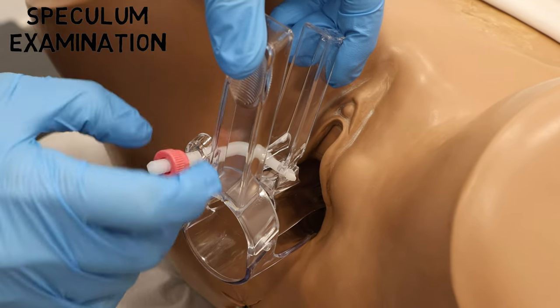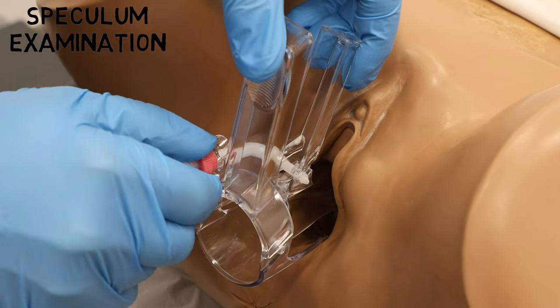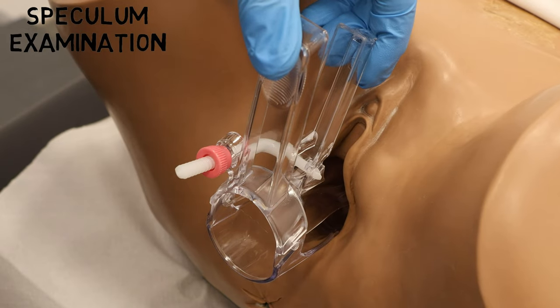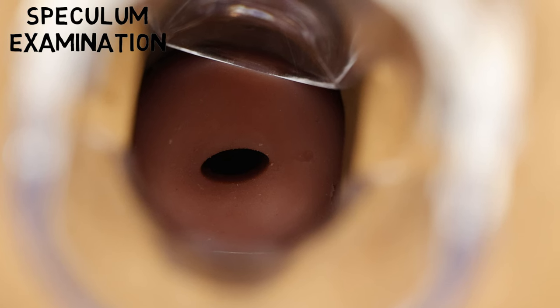Once the speculum has been inserted all the way in, we start to open the blades under direct vision until the cervix has come into view. Of course, you must have some form of light available to see properly. When we are happy, we can use the fixation screw to keep the speculum in place. Once we have done this, we can inspect the cervix and the vaginal walls.